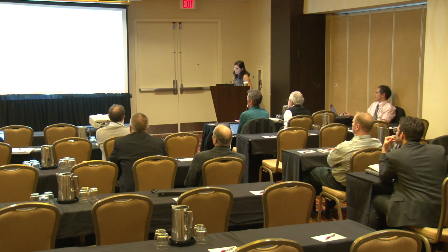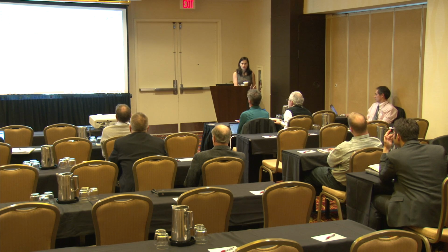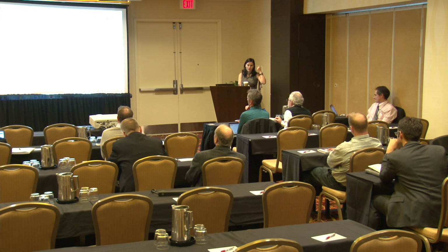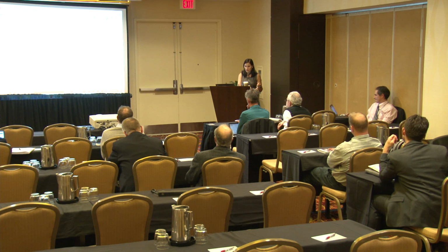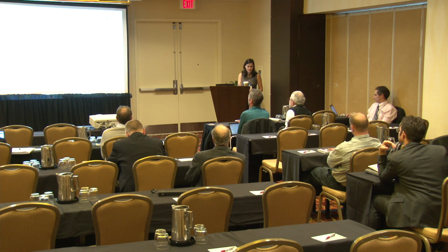So this is the first version of our application. The next steps that we are envisioning are having a tab that allows you to subset for a specific study. We will have more options for the graphical representation, like smoothing, and it will also allow for simulation of TTP.